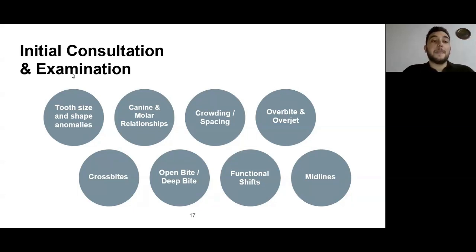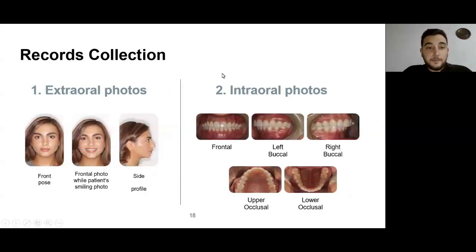and to be able later to document this information during case submission, because once we get to case submission, you need to know that the dental technician that is treating your case, that is moving the teeth on the software, doesn't actually see the patient clinically. So we have to keep that in mind. We have to give the technician the biggest amount of information we have around the malocclusion, around the orthodontic malalignments, and we'll need to document that in the right way during case submission.